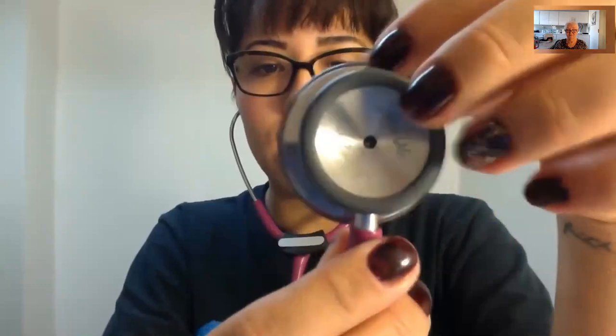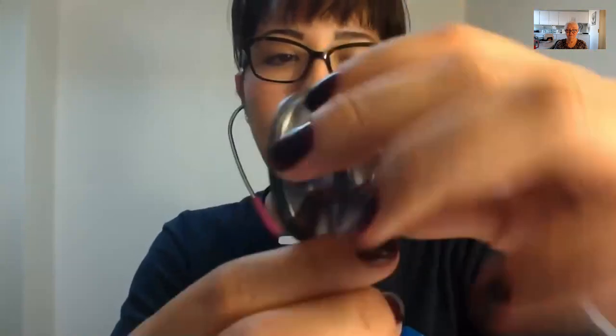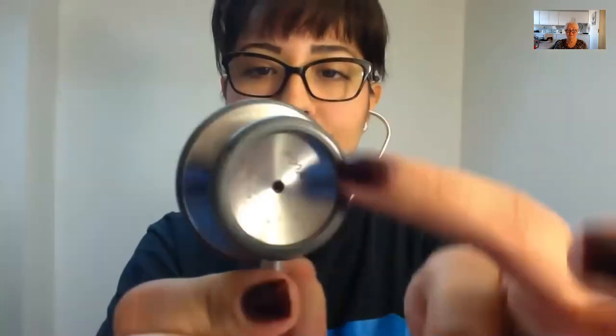For those who have an adult side and a pediatric side, which is much smaller than this one, I don't think you're able to see the hole because you have a side just like this one on this side. Those might be slightly different, but I'm pretty sure there has to be a way. I mean, you don't always have to look in the hole to make sure your bell is closed. If you have it in your ears and you tap it and you hear it, it's really loud, then that tells you your bell is closed. If you twist it and you tap it, and you can't hear what's happening up here, that means it's open.